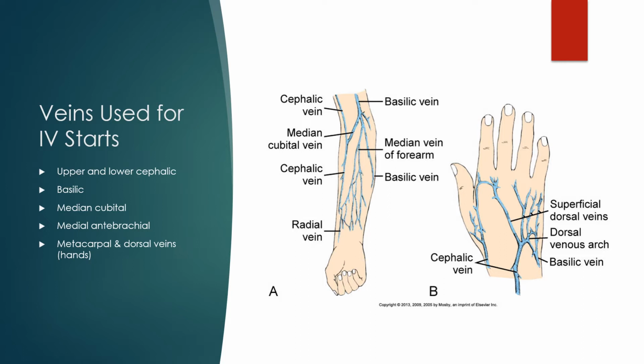So I would encourage you to take your tourniquet, and we'll do this actually in class, and we're going to practice just putting that tourniquet on each other, just so we can get the practice of that. If we don't pick the hand, then we're going to go up towards the head of the arm. We avoid the 2-inch space right above the hand. This area is off limits because there's so many nerves in that area. And if you accidentally hit a nerve, you could cause numbness and tingling into those fingers.